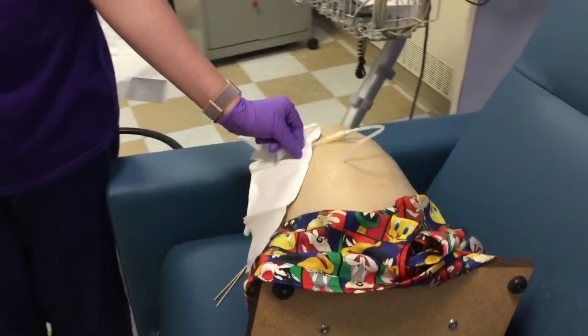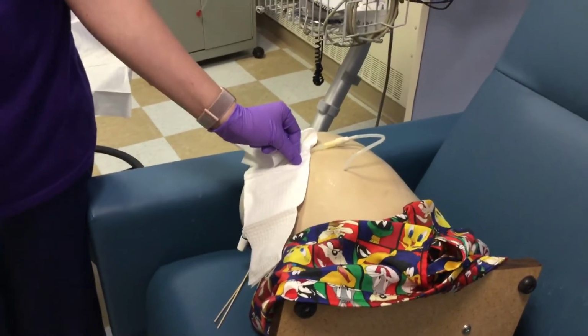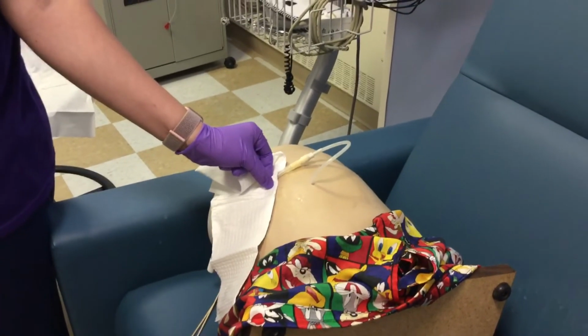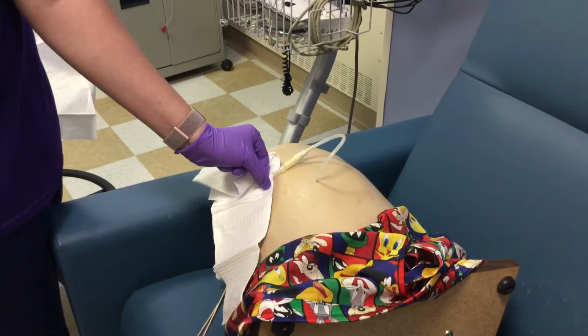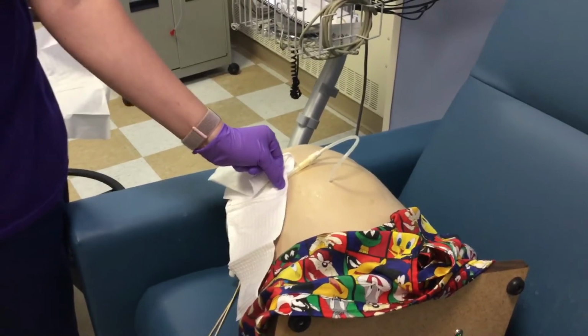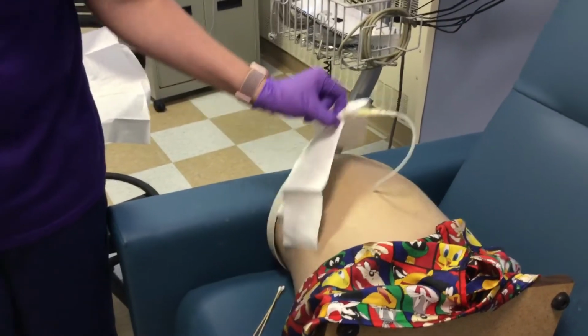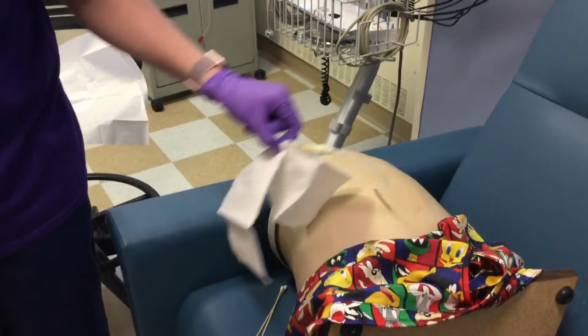Next, you will let it air dry. You can use additional Q-tips to help dry if needed. Then once dry, you will loop or coil the external part of the catheter to help prevent tension.